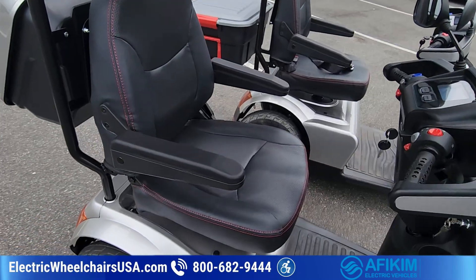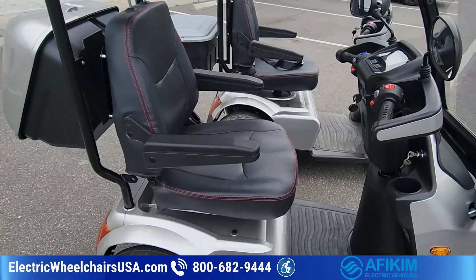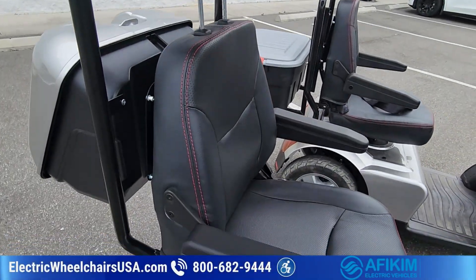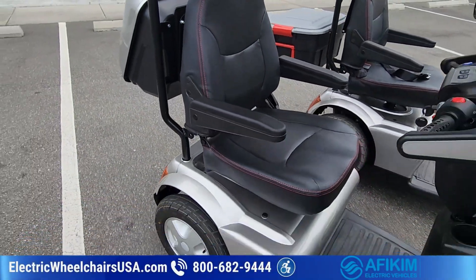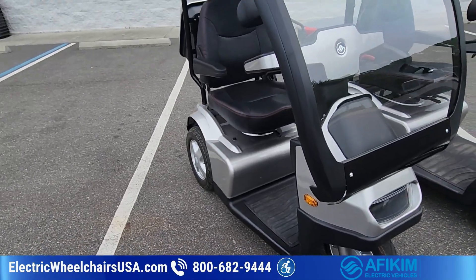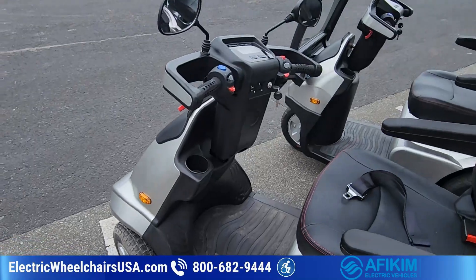For seating, you come standard with a 20-inch wide seat, but you can get a 22-inch, a 24-inch, or a dual seat that's 33 inches wide. Personally, I'm about 230–235 pounds and six foot four, and the 20-inch wide seat is plenty for me, but you have the option to get a bigger seat if you want.